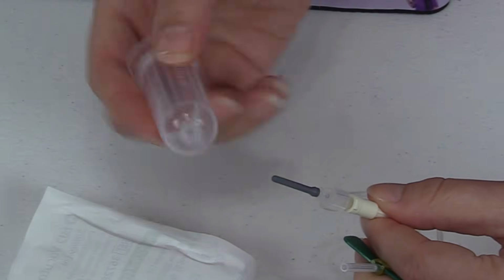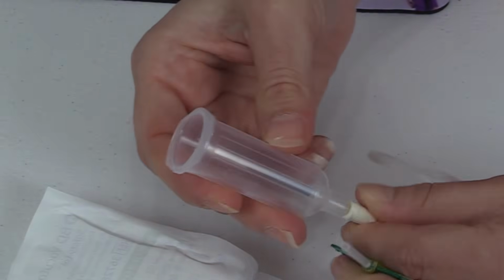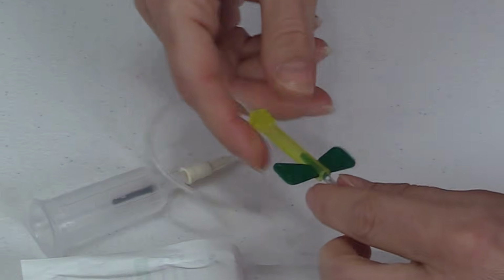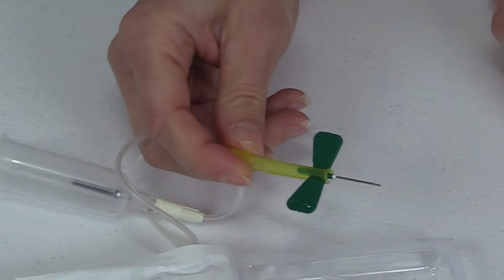Now, this tube holder actually screws onto here like this. And you will pop your tubes through here. Now, another part, one of the most important parts of it to prevent injury, I'm going to take this little sheath off so you can see how it works, is the little safety activation.